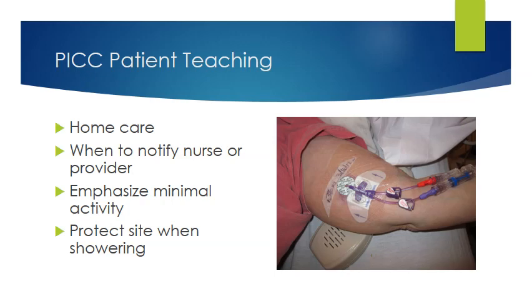This picture on your slide here is what a PICC looks like in a patient's arm. That's what you will see if you go into a hospital and a patient has a PICC. That's exactly what it looks like. This is a double lumen.